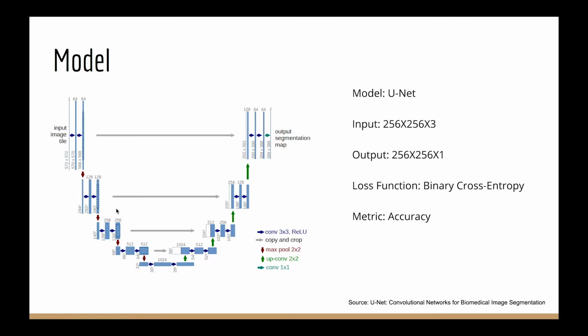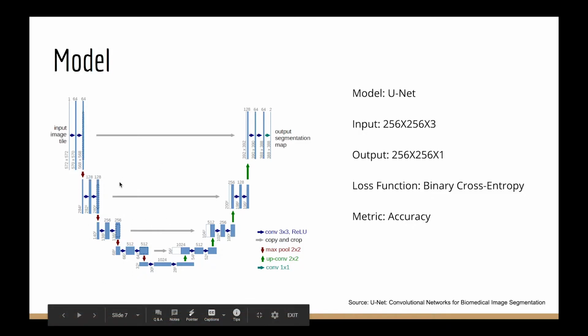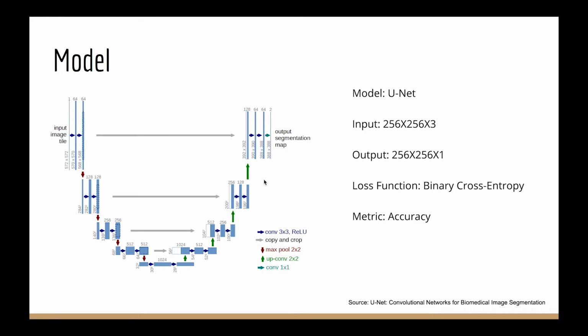Now let's talk about the model. When we first thought about this project, we immediately thought about using a model like Inception because it is a project dealing with images. However, after some trial and error, we realized Inception is good for image classification because it can extract filters from the image. However, we treat this project as an image segmentation problem, so we switched to UNet. The UNet combines the location information from the downsampling path and, in the upsampling path, it obtains the general information, combining localization and context, which is necessary to predict a good segmentation mask.